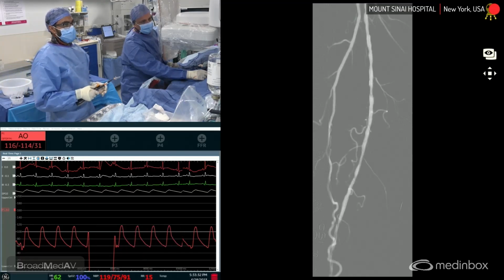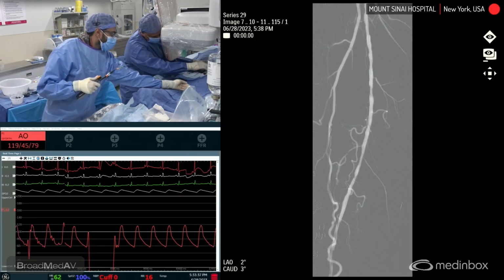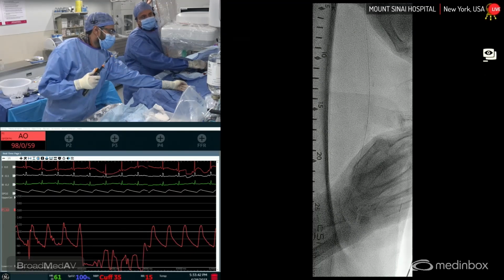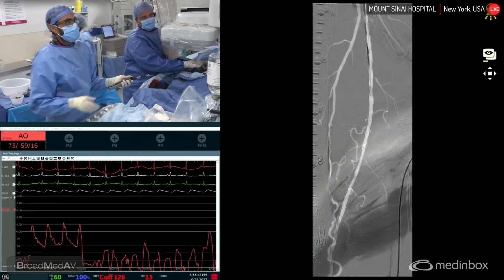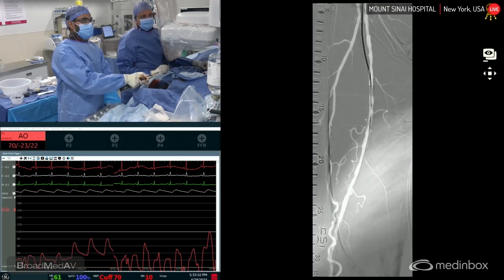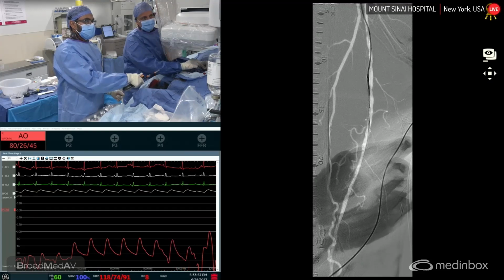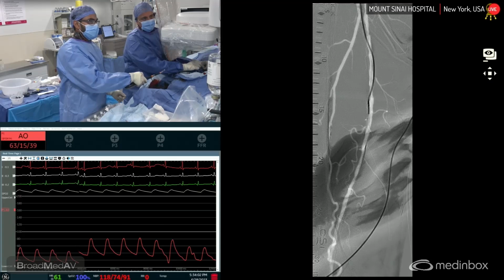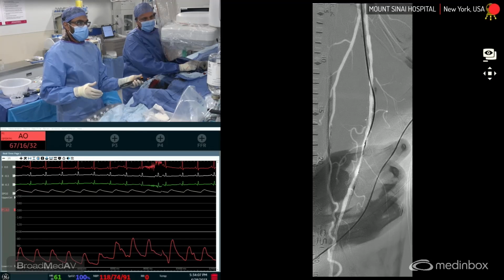Flow is already better. So I may do a lateral cut here on the proximal. So Ibrahim is going to rotate it laterally, which is exactly opposite of where we started, which I think should be right there. Okay, on. Again, a very short focal cut here. Off. And then I want to cut over here. Okay, on.